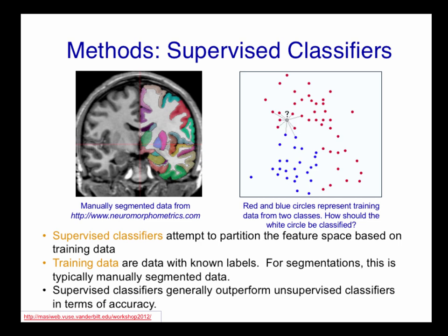But if we had one that was way out, not close to our other neighbors, the k-nearest neighbor might have some problems here, because if you have sparse training data, the closest label within your feature space might really have nothing to do with that position, that intensity value. So in that case, some of these other methods might be more appropriate.